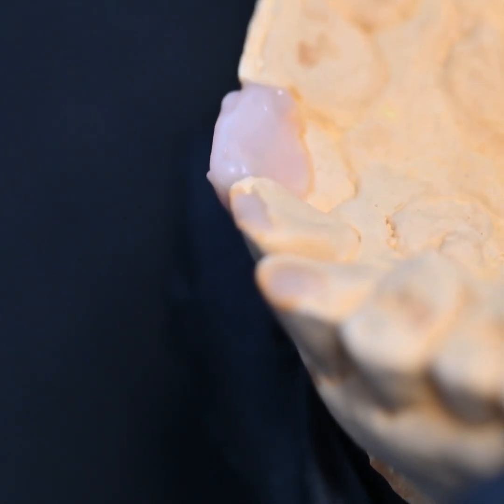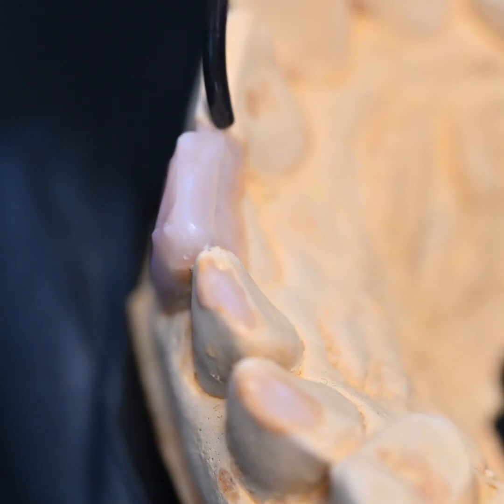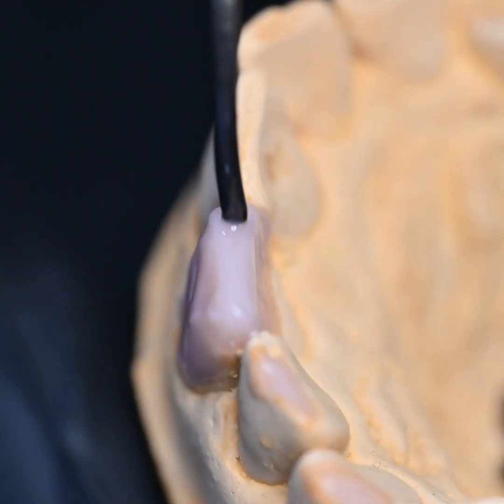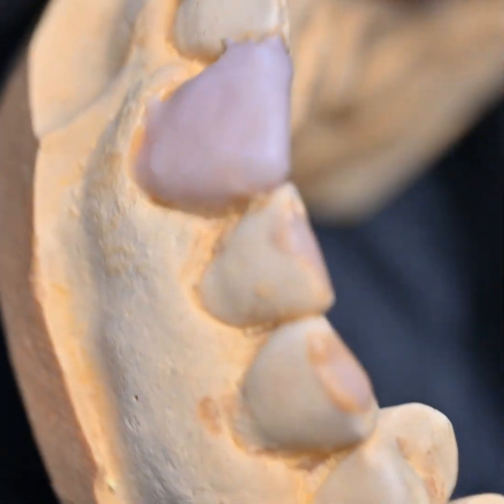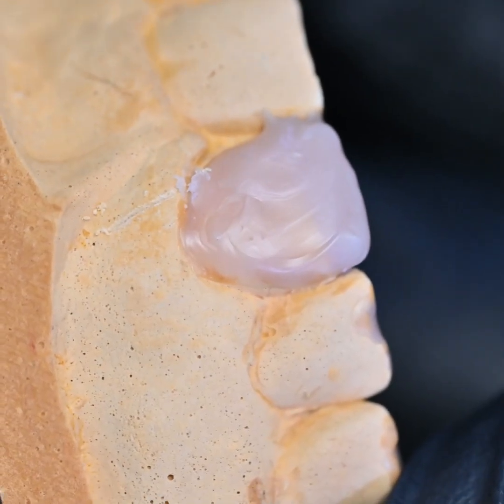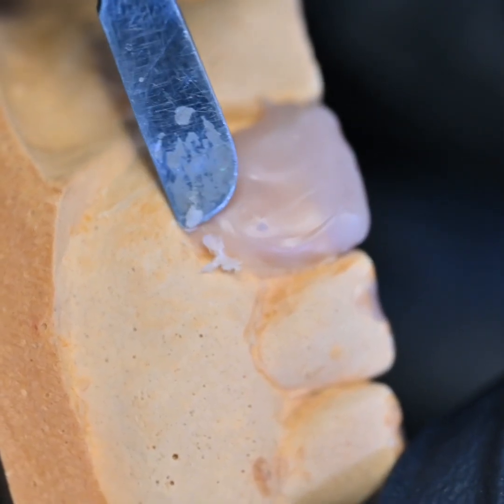What we have to do is merge the wax with the existing portion of the tooth so that there is a smooth finish — no abrupt step. And now comes the most beautiful aspect of this work: the carving part.